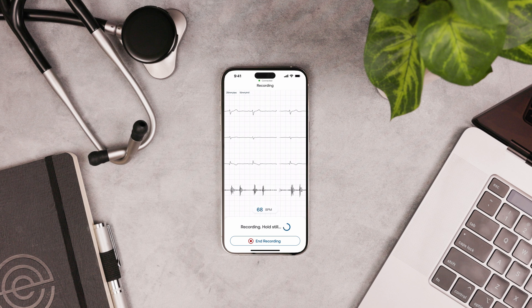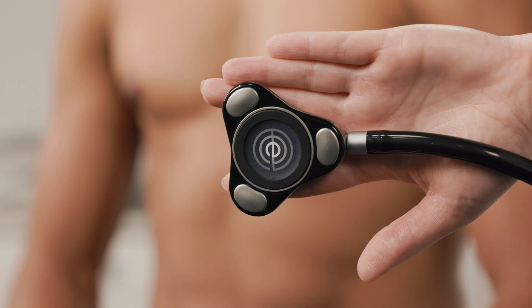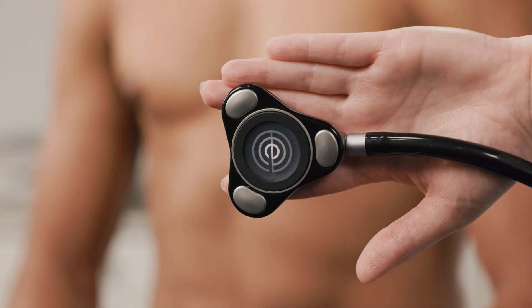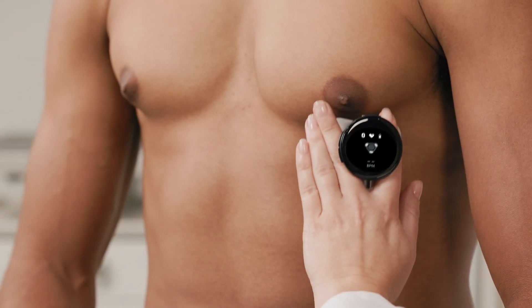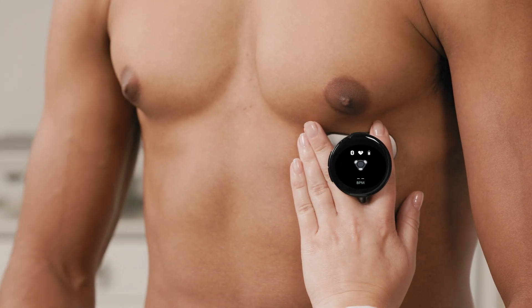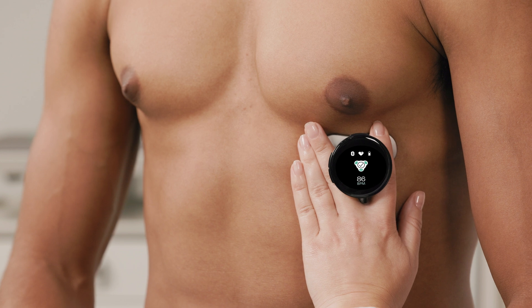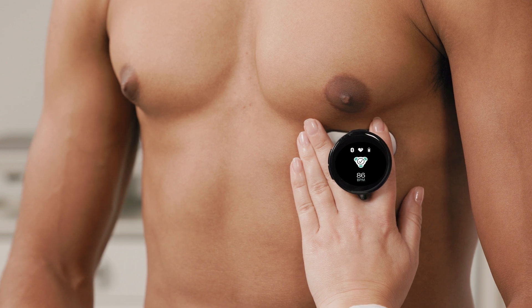We'll show you how to create an Echo account and connect the Core 500 with the app. We'll also give you a tour of the main features. Let's get started.